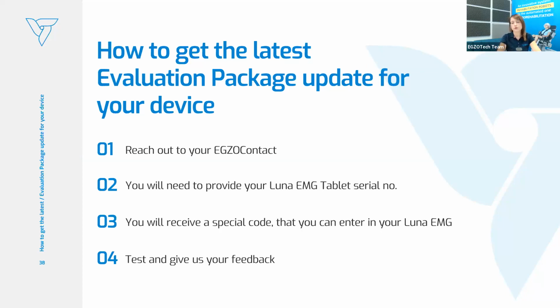So again, if you receive the code, you're already able to test them and give us some of your insight as well. And again, if you want to do the research, you can contact me directly, and we can think about nice validation protocols that will help those tests to be used widely by researchers all over the world.